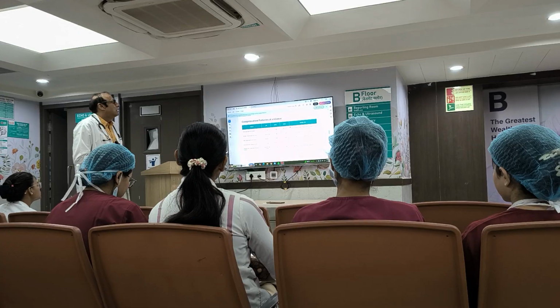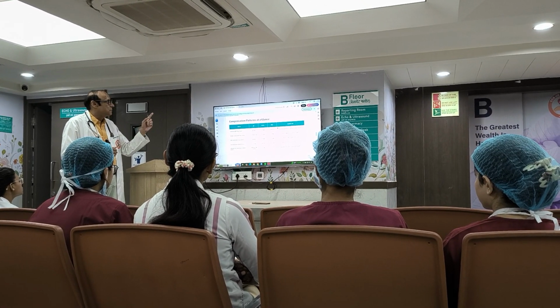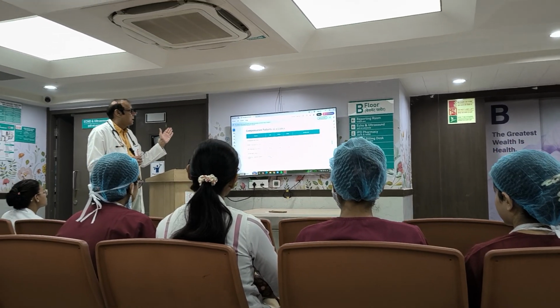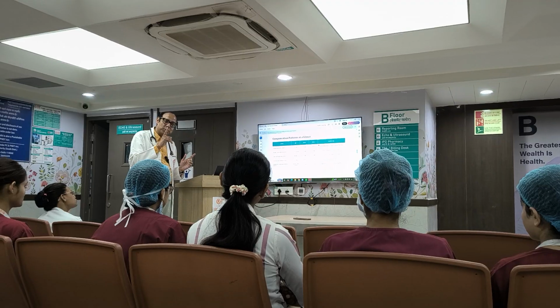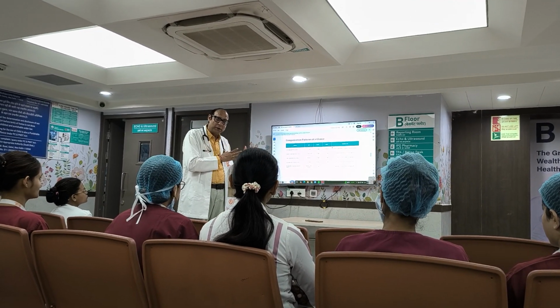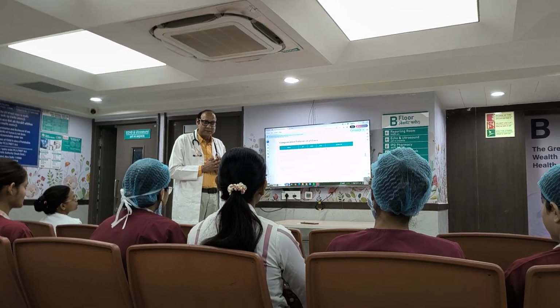So that also we have already discussed before. Compensation pattern of the gas. So which way compensation acidosis? What I said before, acidosis is with respiration, okay, and the metabolic part is bicarb. CO2 is going to be controlled with the lungs.